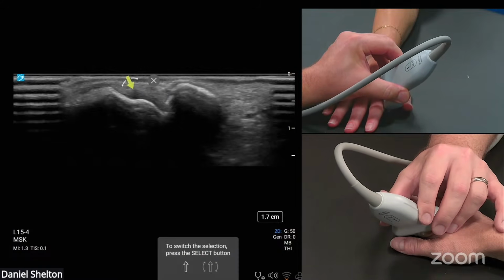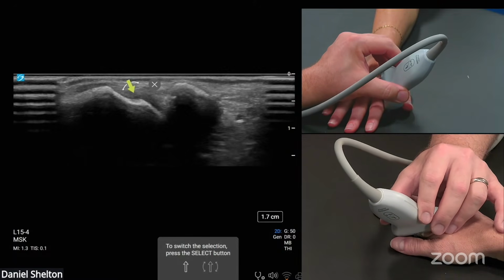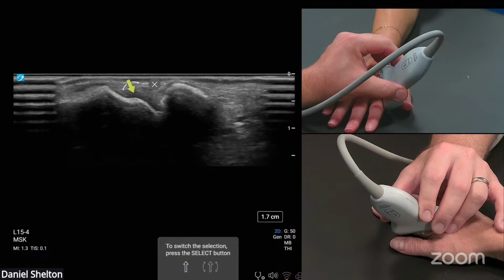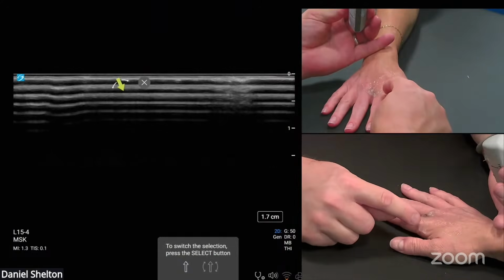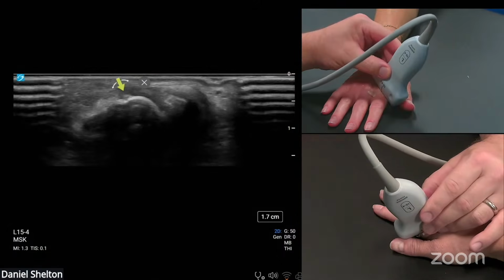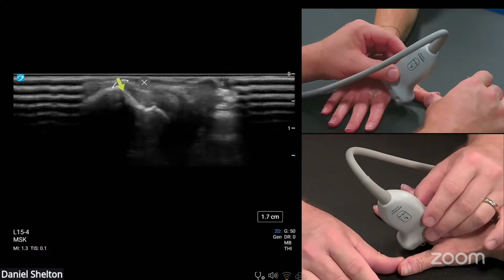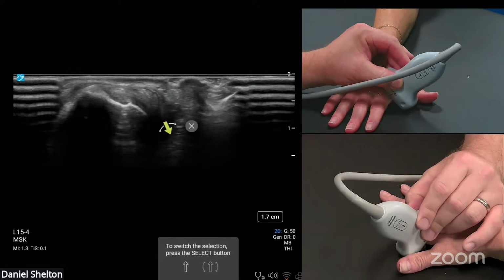So that's the primary, or as you saw in the anatomy diagram on the slides, think of it as the posterior of the two. So it's a P for primary. And then we have an accessory collateral ligament, which dives straight down all the way to the pulley system. I'll open up the thumb here just to give me a little bit more scan angle. And there you can see the shadow of the accessory right here, diving towards the table.